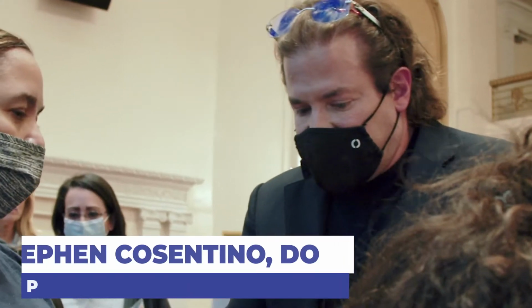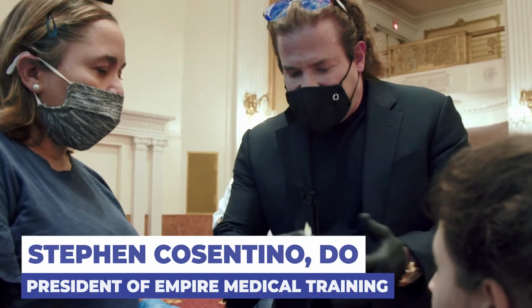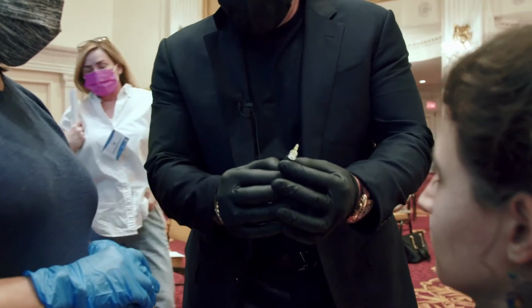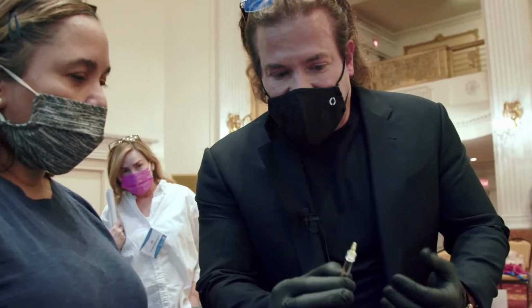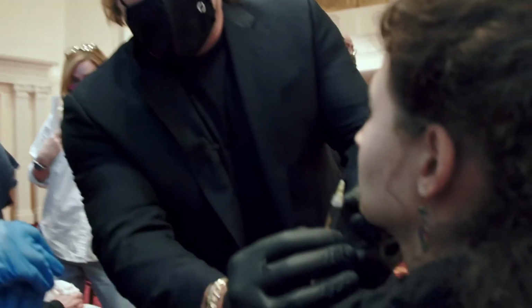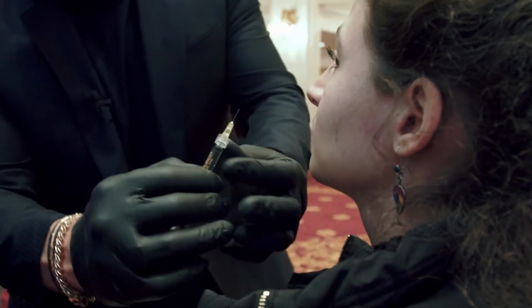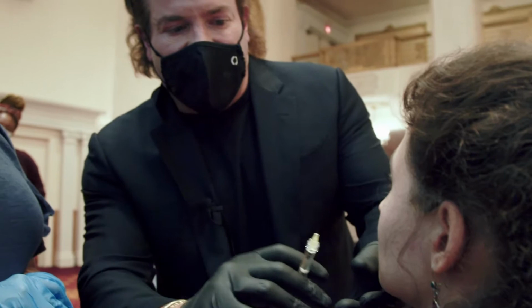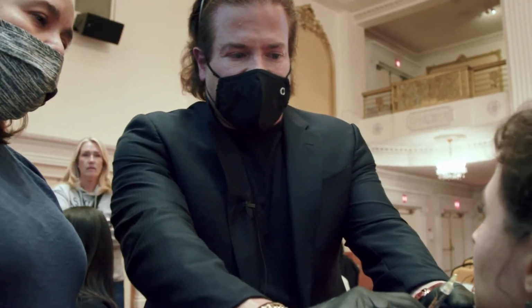And this is really important: hold the syringe the right way. So the right way to hold it is like this. The reason is, technically you can hold it any way that's comfortable, but if you hold it like this, right off the bat you're going to be too superficial. You see how that is? If you hold it like this, you're too superficial. If you hold it like this, you're going to be way too deep. But if you hold it like this, almost without even doing anything, you go in and you're at the right depth.